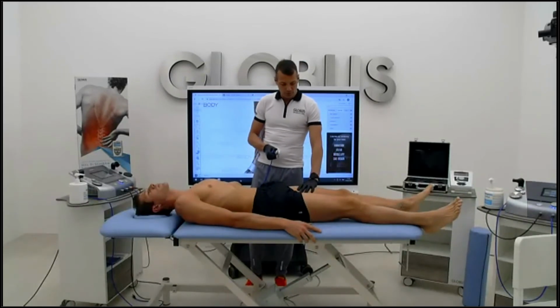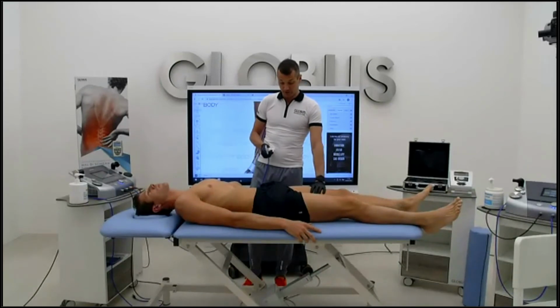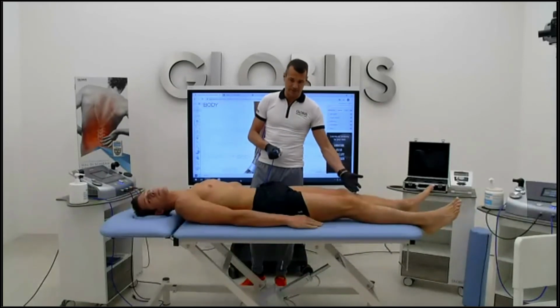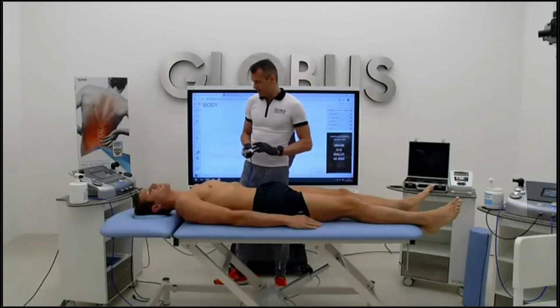We can do it proximally, or maybe on the back part, or on the glutes. All that can improve the healing of the distal part and increase the recovery processes.